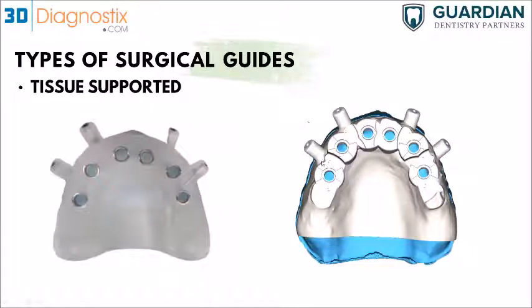And those extensions on the buccal surface, those would be the sleeves for the fixation pins. So this is an extra means of retention. As you all know, with the tissue there are no undercuts. Sometimes you would rotate the guide, so you need to make sure that the guide is stabilized by those fixation pins. We get the anchorage from the bone, of course. And once you have those pins placed in, you then use the guide without any problems.